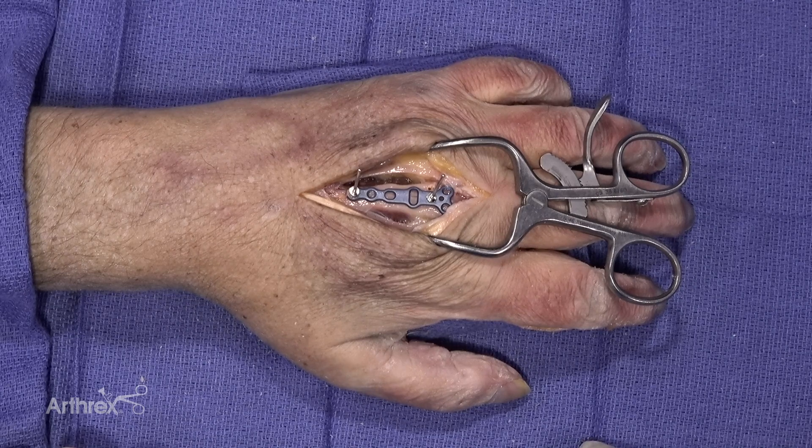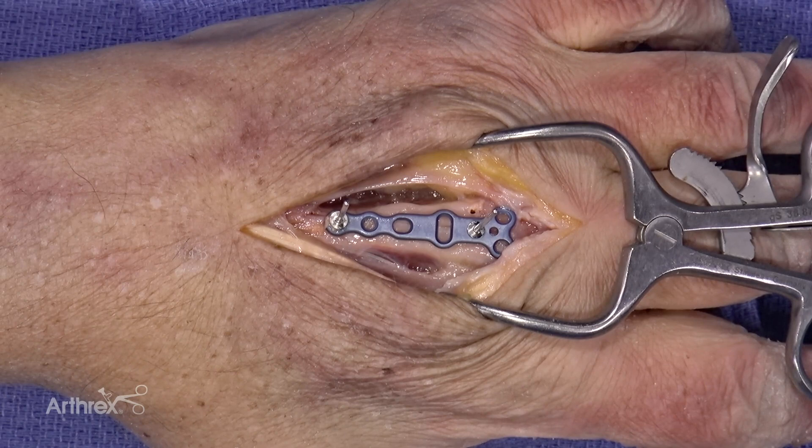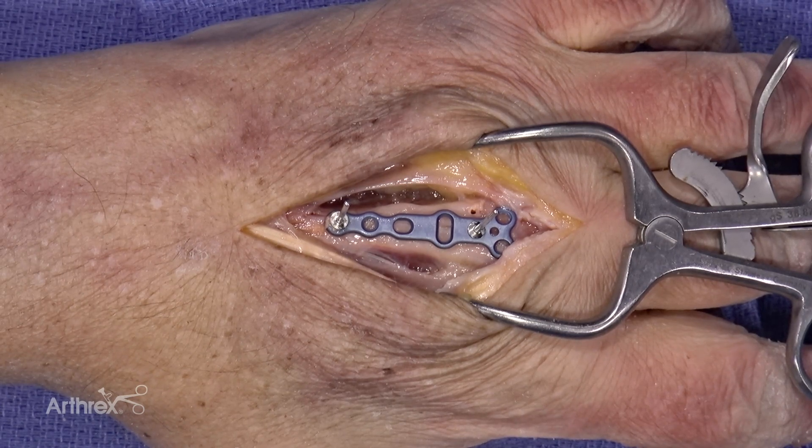I've begun by performing a dorsal approach to the third metacarpal, and I have pinned into place using the BB-TACS the rotational correction plate. In this situation, I am centering my osteotomy more towards the distal metaphysis.